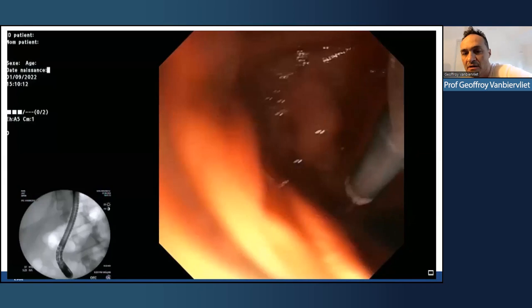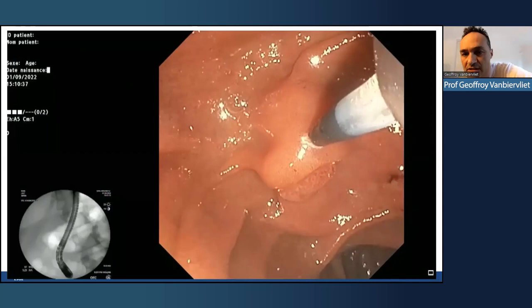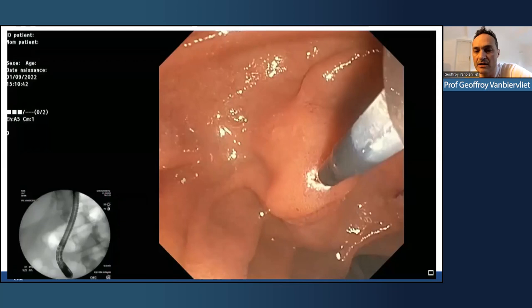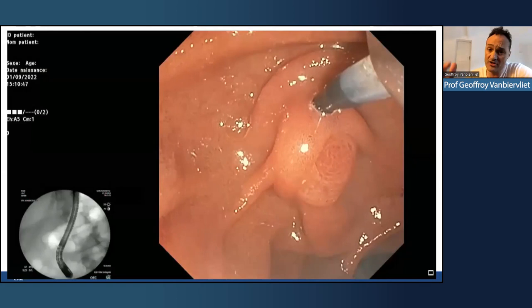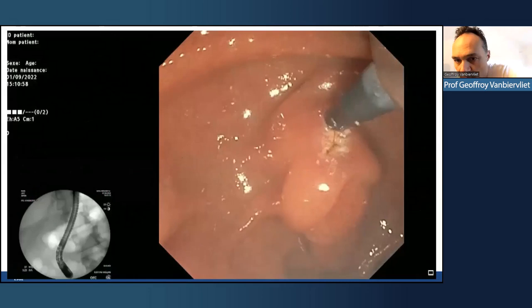And like this, you will start, and I prefer to start when there is a bulging effect of the infundibulum. It is a type 2 or type 3 of anatomical classification. I try to use the fistulotomy because we know that with this technique, you reduce the risk of acute pancreatitis significantly because you are not in contact with the pancreatic duct.